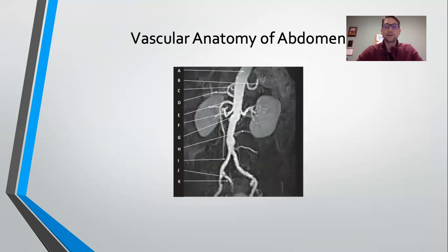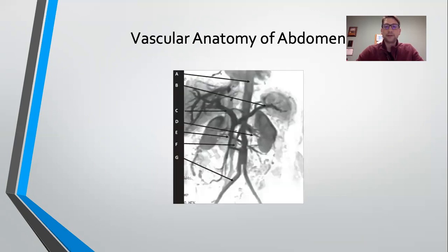So this is arterial. This here, you can see arterial and venous blood flow. So arterial blood flow is always going to be a little bit more midline, and then venous blood flow going back up the portal vein is going to be a little bit more to the patient's right, because their liver sits on the right side of the patient.